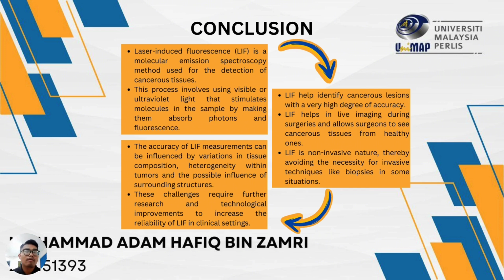However, the accuracy of LIF measurements can be influenced by variation in tissue composition, heterogeneity within tumors, and possible influence of surrounding structures. This challenge requires further research and technological improvement to increase the reliability of LIF in clinical settings.